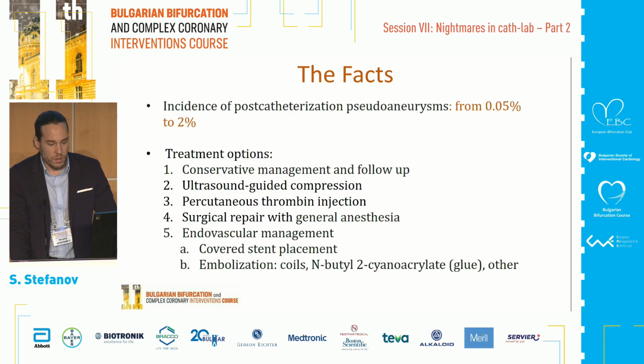The stent is at risk of compression or twisting, which will cause turbulent blood flow inside the stent and will greatly increase the risk of stent occlusion. So we were left with the option of embolization.